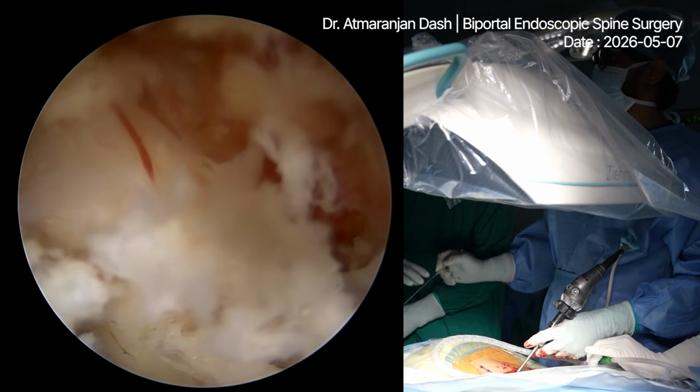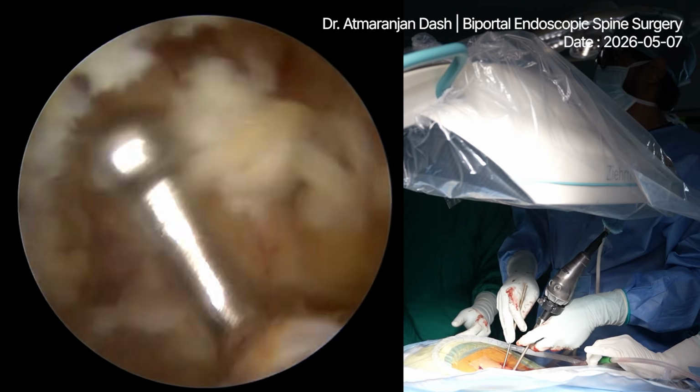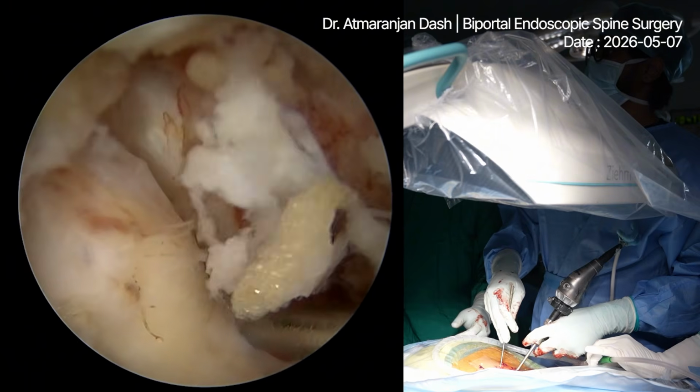Okay, saline please. Smaller one you give. So the foramen should be adequately decompressed, otherwise there will be issues with the patient.